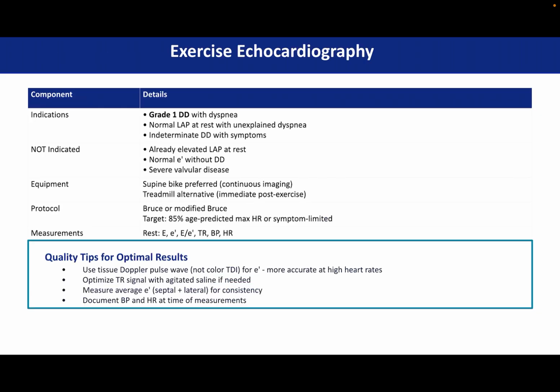Exercise echocardiography, indications and protocol. Exercise echo is the bridge between a normal resting echo and the clinical reality that many heart failure with preserved EF patients look completely normal at rest. Their diastolic reserve is exhausted only when demand exceeds capacity during exercise.